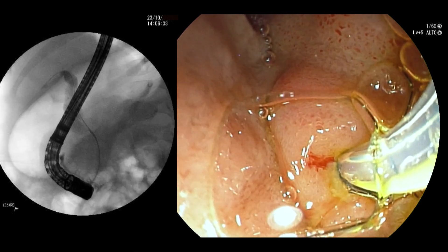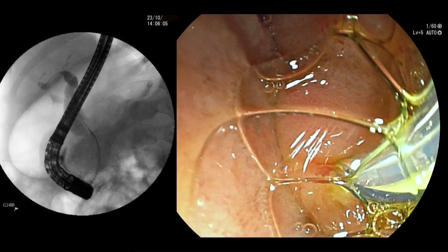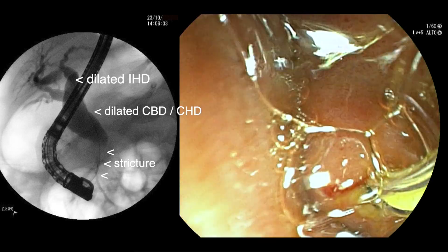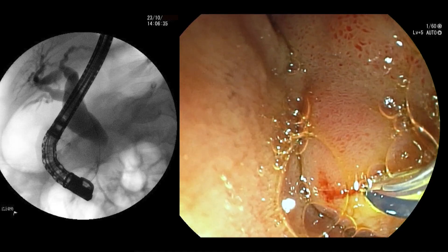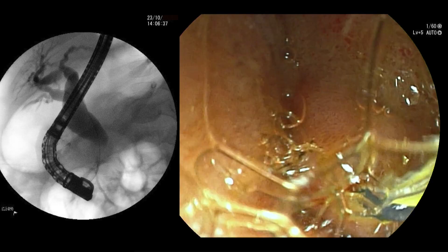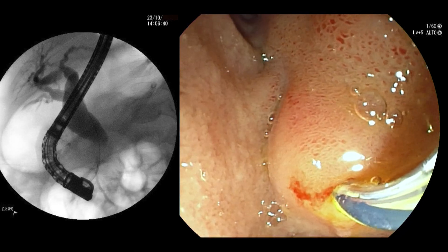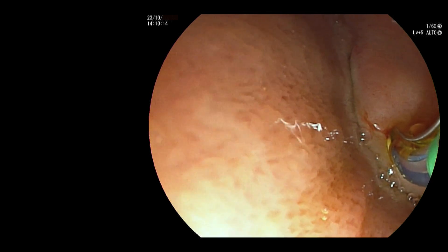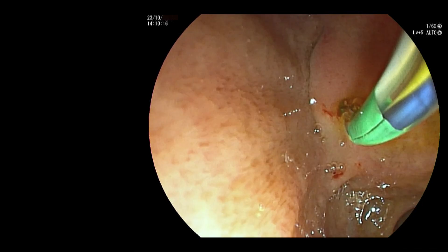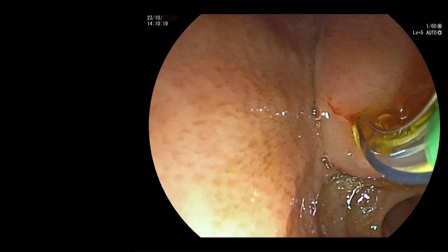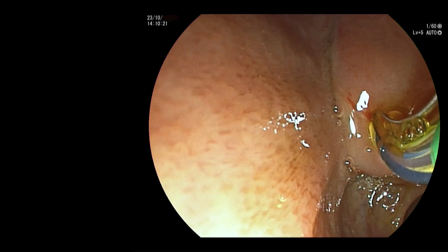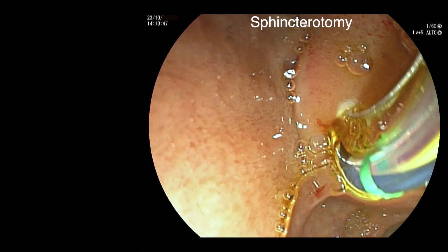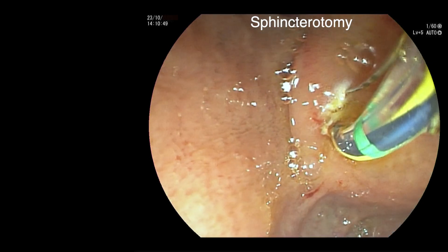The cholangiogram shows a very dilated common hepatic duct and intrahepatic ducts above a three centimetre stricture in the lower common bile duct. A small biliary sphincterotomy is performed.